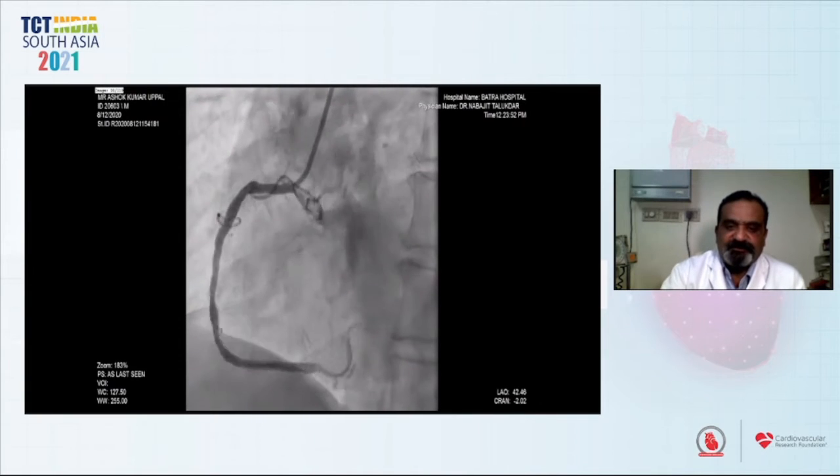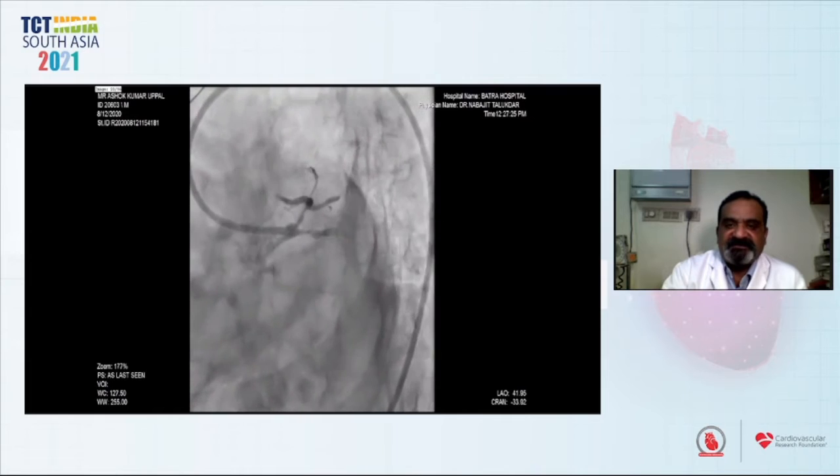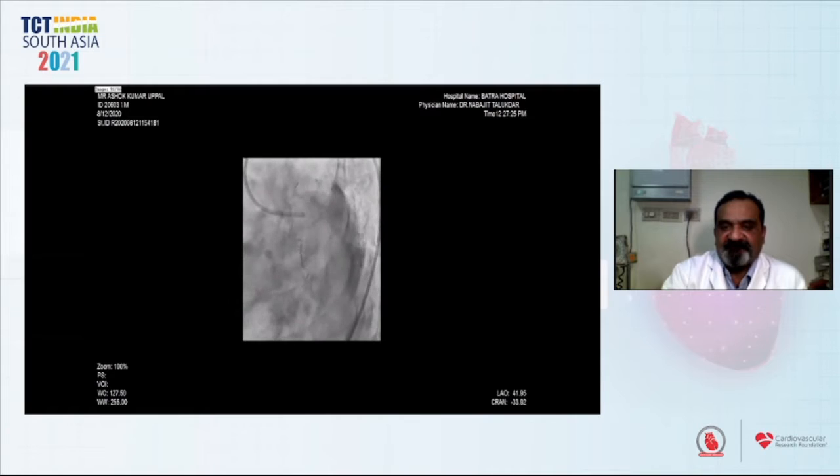The right side looked okay. On the left side, we see almost from the distal left main, there is critical LAD and circumflex disease.